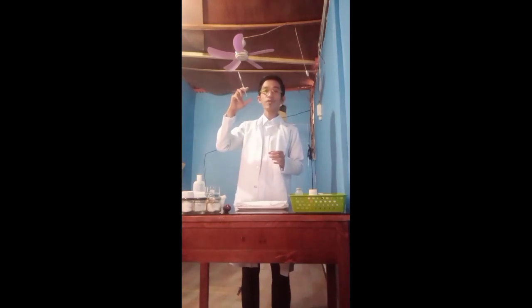And next is to invert the vial while keeping a firm hold on the syringe and plunger. Hold the vial between the thumb and the middle finger of the non-dominant hand to avoid contamination. So do not touch this part of the syringe. Grasp the end of the syringe barrel and plunger with the thumb and forefinger of the dominant hand to counteract pressure on the vial, to allow fluid to settle in the lower part of the vial and to prevent any forceful movement.